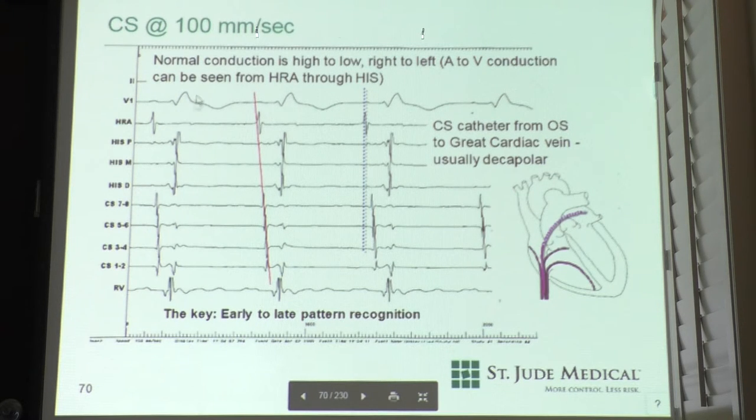Whenever you come into a cath lab or an EP study, you're going to be lost looking at these signals to start because there's a lot of information to process. But if you're lost as to what's happening, look up to the EKG, right? Because that's kind of the story of what's going on. So what's that? Yes. It is. So this is the beating of the ventricles. So what is this probably?